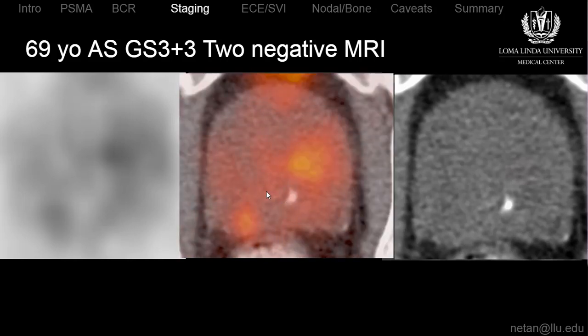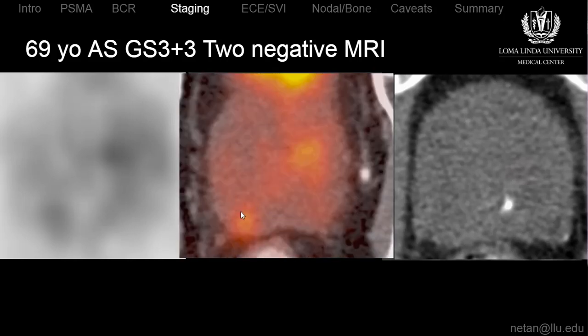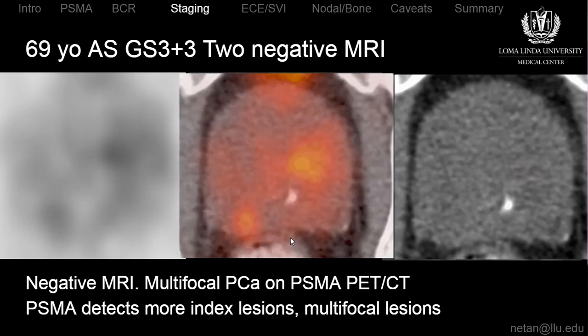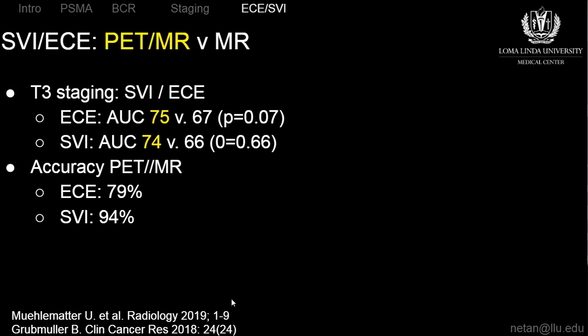I would probably recommend a targeted biopsy in this region because we know that prostate MRI misses up to 20% of index lesions. So PSMA, we know, detects more index lesions and is very sensitive for identifying multifocal prostate cancer compared to MR. And thus, there is potential role of PET MR for evaluating men with possible prostate cancer, both to identify as well as to localize the number of prostate cancer foci.